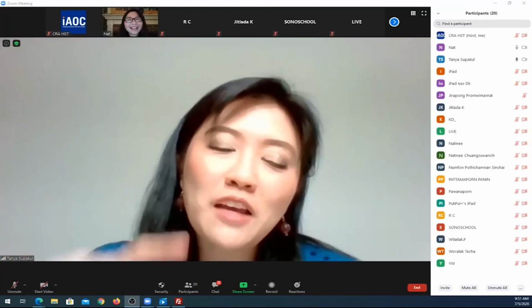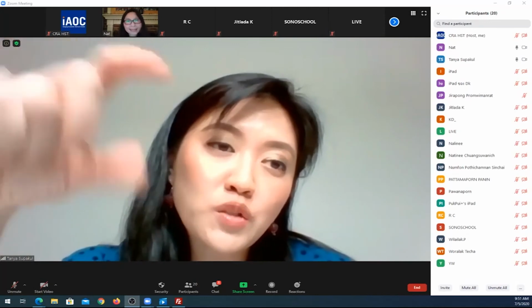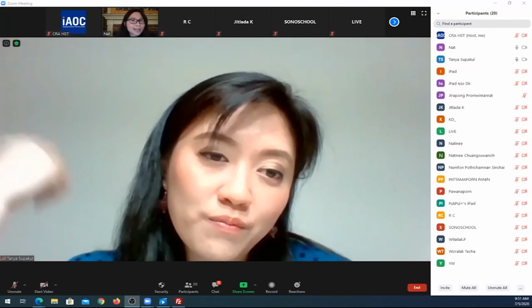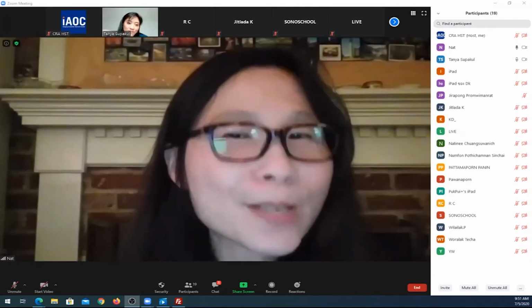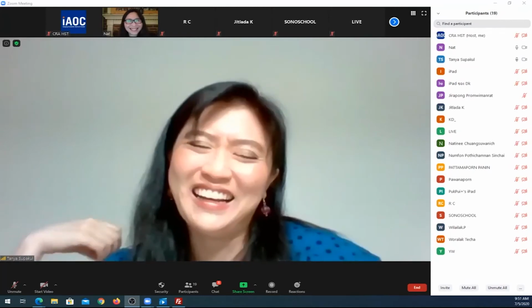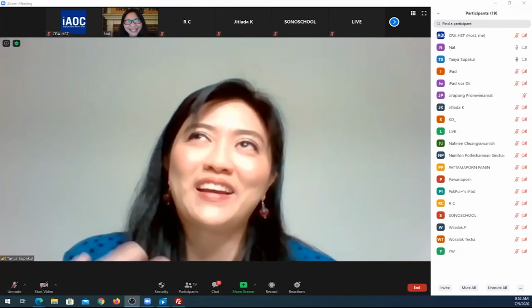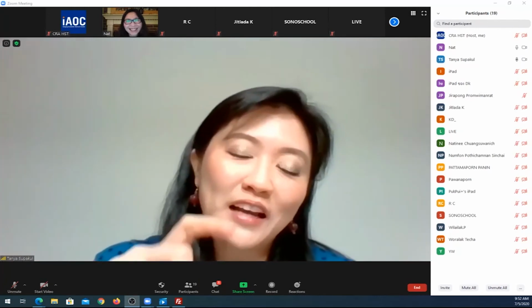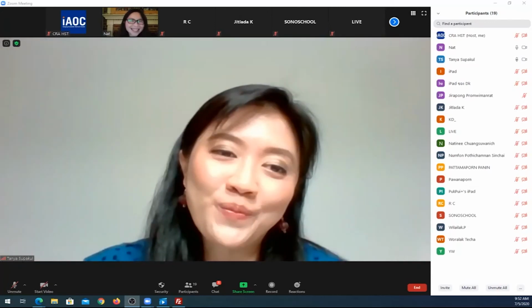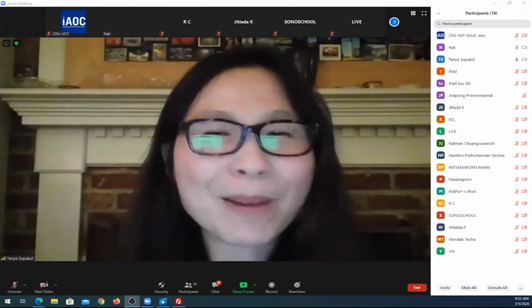No, but I mean dual energy and spectral CT help with the contrast volume. Yes, because you can lower the contrast volume maybe by 50% of the normal volume. People say that, but I'm not brave enough to do that yet. So you mean you need more research or practice to confirm how much you can reduce the volume, right? Yes, I think so. At the moment, we still use the same amount. Yeah. So another question.